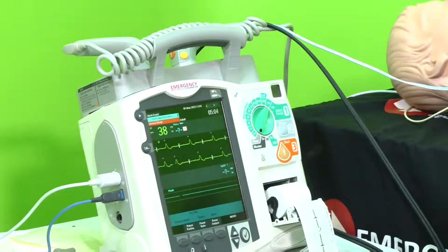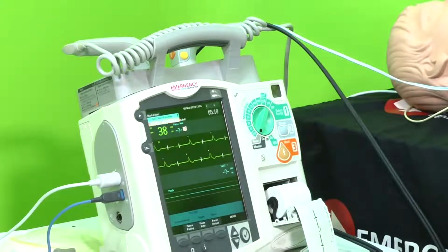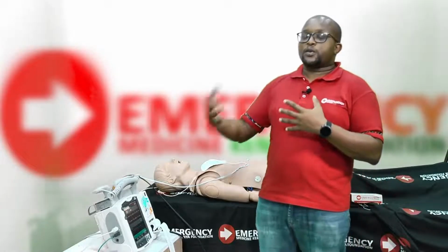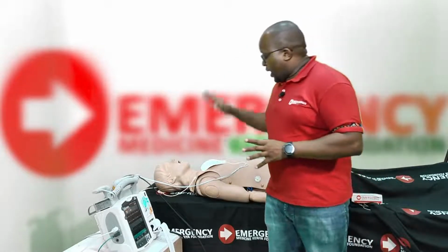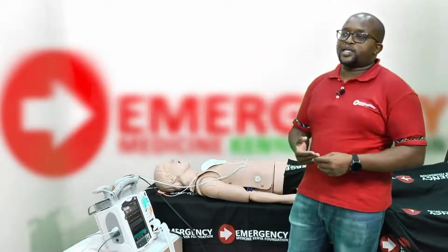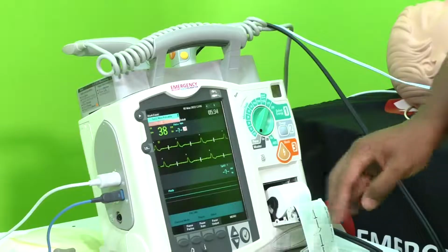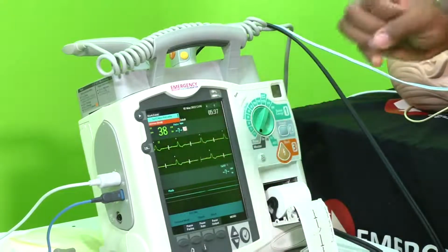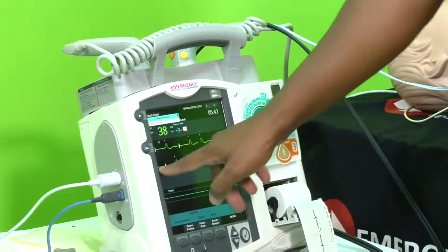Once I have the pacer rate set, the next thing I'm going to do is go to my pacer output. Now, pacer output is energy being delivered into the patient, and we want to deliver enough energy to stimulate what we call response on the patient. So for every pacing spike, I want to see a wide QRS next to it. That essentially means the electricity is going to the heart and is stimulating a beat, an electrical beat. So every pacing spike must be followed by an electrical beat. Right now we have the pacing spike but no beat, and the two are independent of each other.